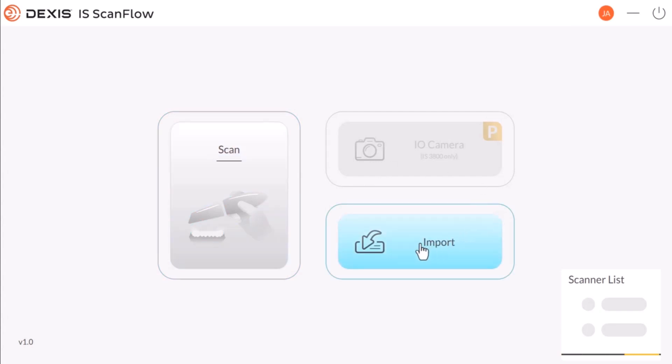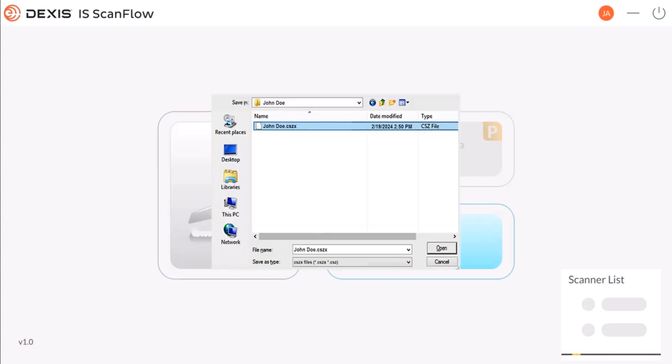Select Import. The Import window is displayed. Choose the cszx file location, select the patient's name, and click Open.